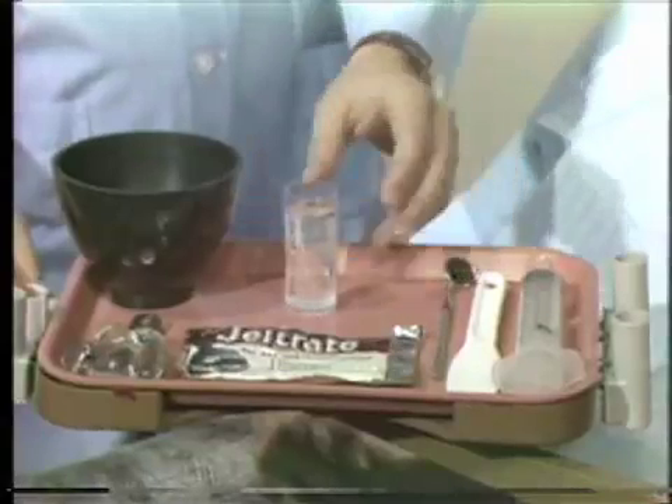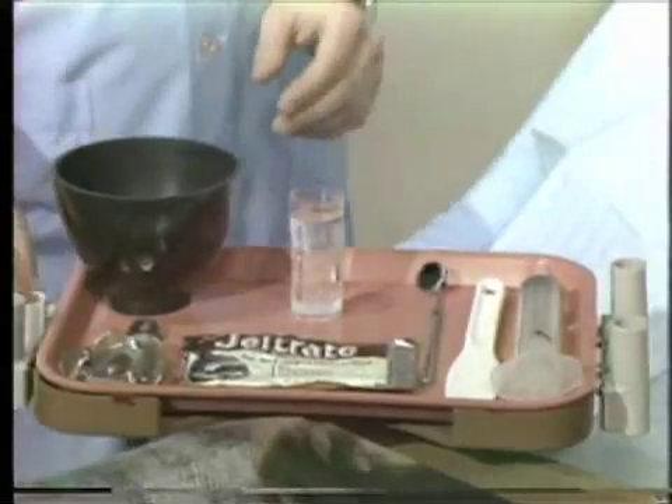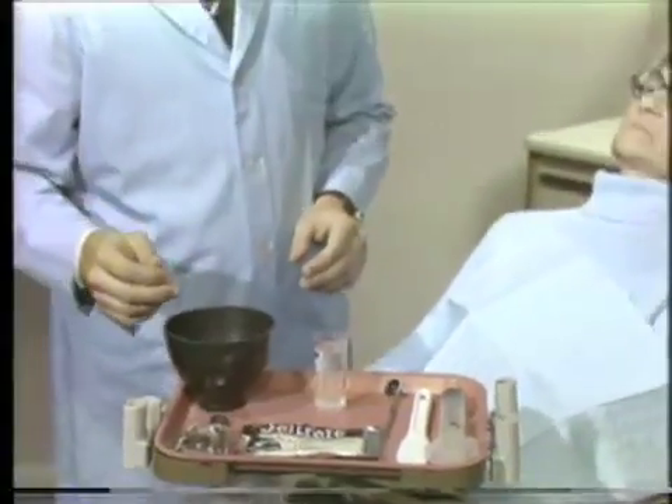Additional items include a mouth mirror, alginate, and water. The ratio of water to powder for the alginate material should be two and one-half measures of water to one package or three scoops of alginate impression material.